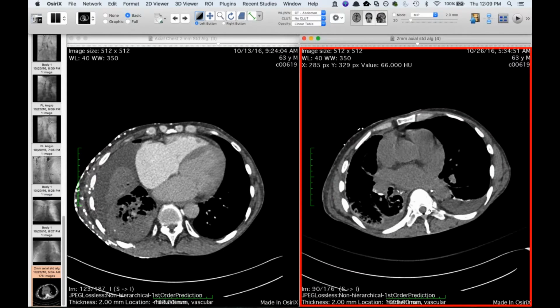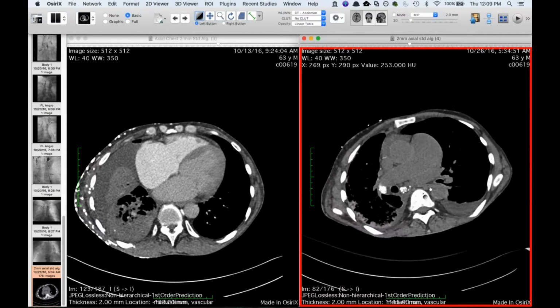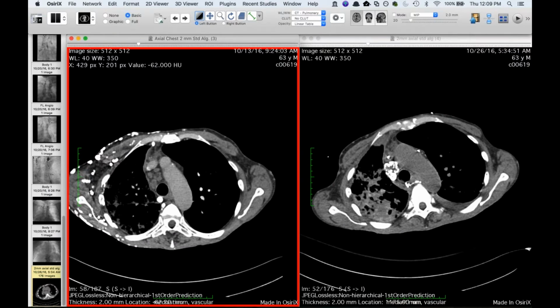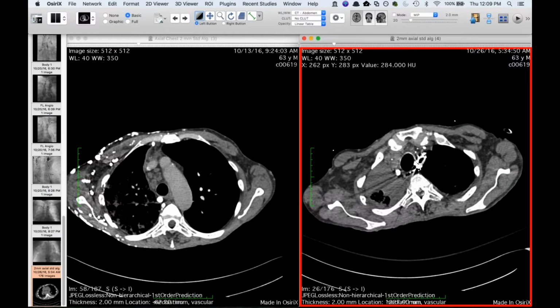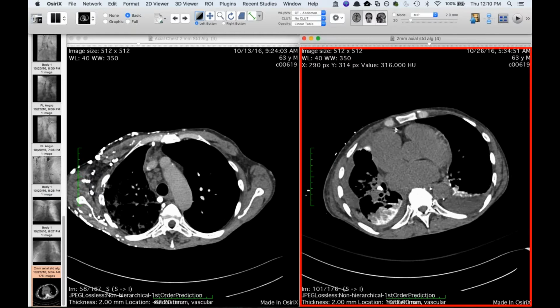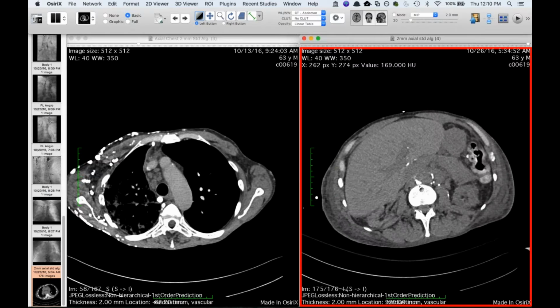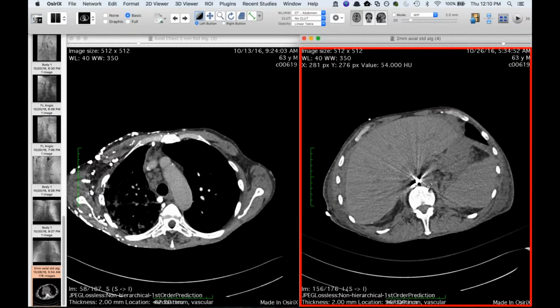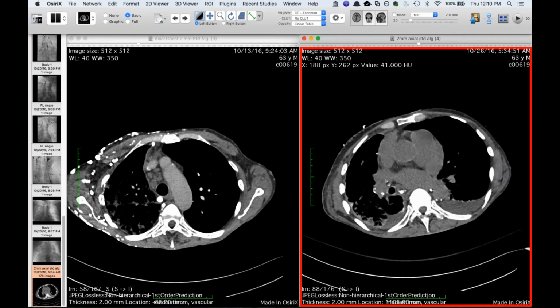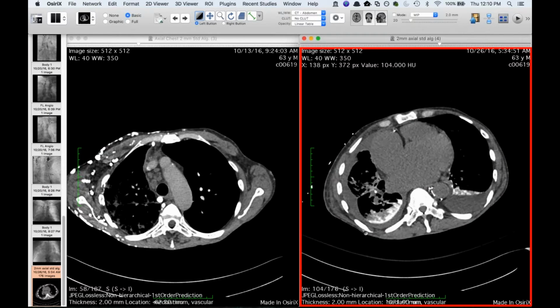But as she pointed out, look what you also see in this case, which is a lot of this high-density material along the thoracic duct, and also look at these lymph nodes that are now lighting up like crazy. And so this is all Lipiodol from a lymphangiogram, and what they did, a lymphangiogram, and then they did a direct puncture and coil of the thoracic duct to attempt to cure his chylous effusion. And you can see it's decreased now. He still has the pigtail catheter, and so I don't know if it's worked or not.